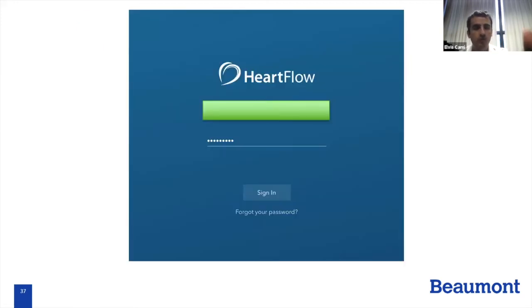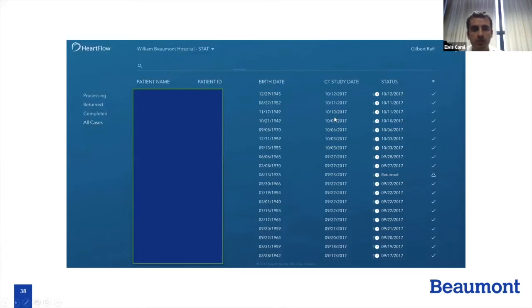And then we go to the HeartFlow website, use your Beaumont email and password, and this is essentially what it looks like, a list of all of our cases. We'll log on to the website, look at the results, and then addend the results in Epic.